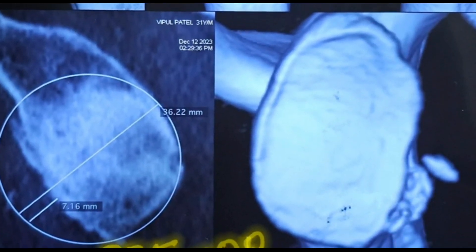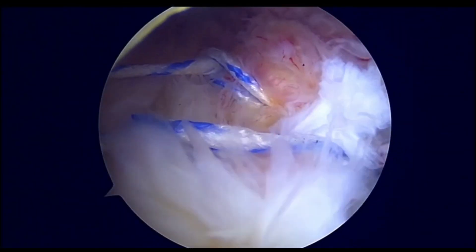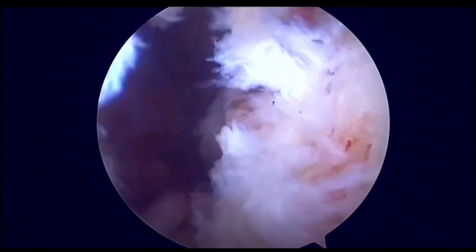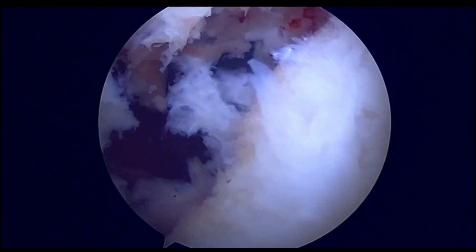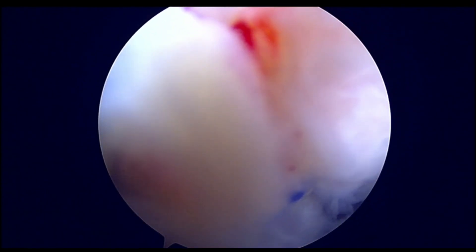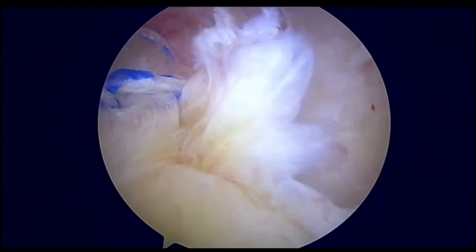We are describing a novel technique for bone loss in recurrent dislocation. What we can appreciate here is about 20 percent of bone loss on the anterior aspect of the glenoid neck, along with some consolidation in the vicinity. These kinds of patients present a therapeutic dilemma to the surgeon, and the standard treatment offered is the Latarjet procedure.